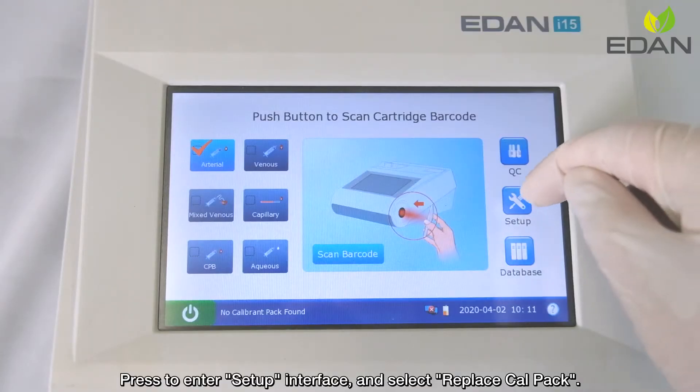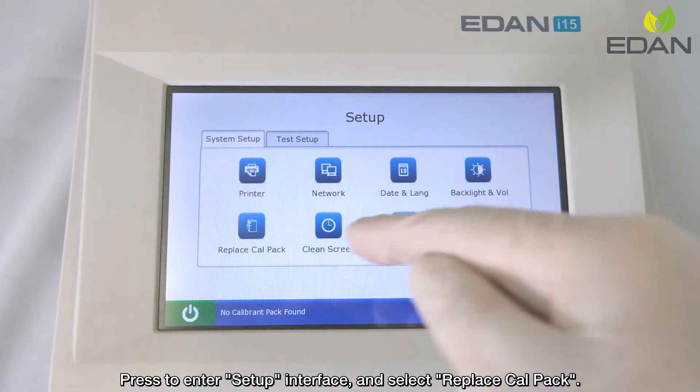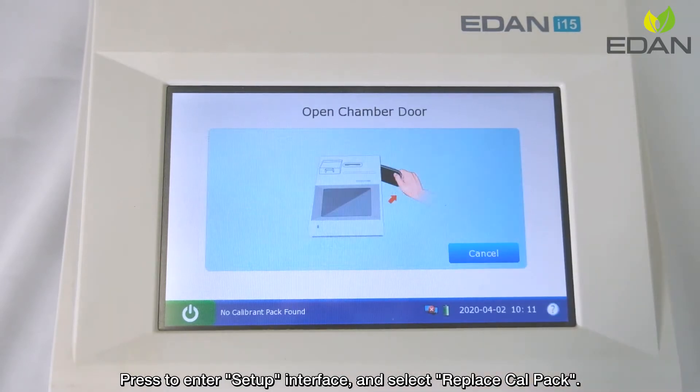Press to enter the setup interface and select Replace Calibron Fluid Pack.